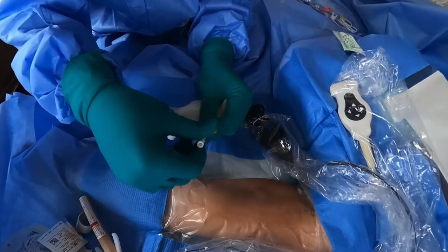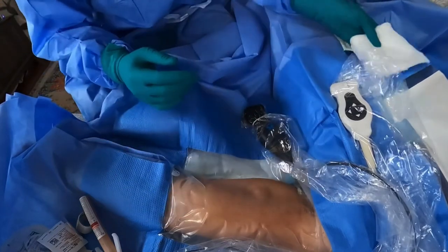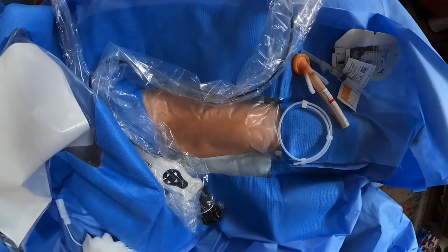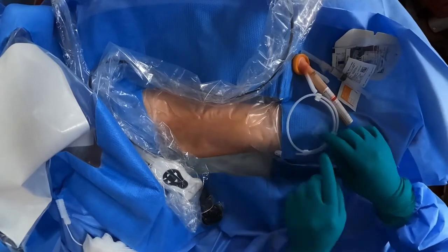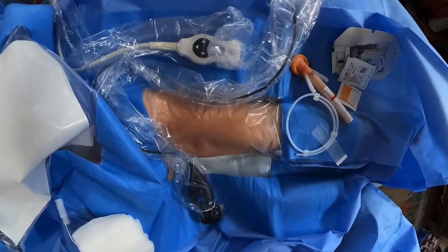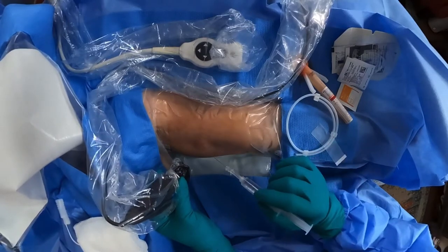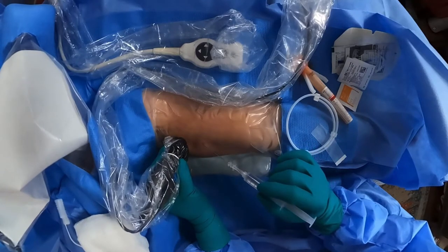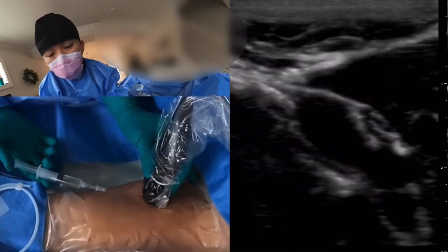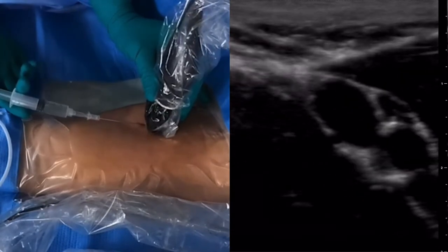While that numbing medication is working — which takes about two to five minutes, maybe less — I'm going to show you how to do a skin prick test to make sure he doesn't feel it. Can you feel this? Tiny bit. Can you feel this? Nope. Awesome. Good deal. So we're gonna get going. There's my needle point and I'm going to stay very shallow, but subdermal.